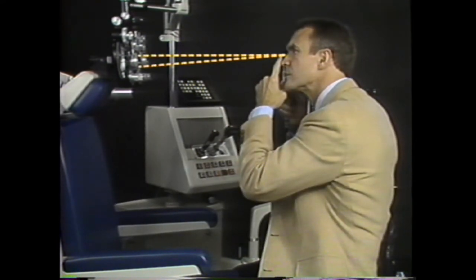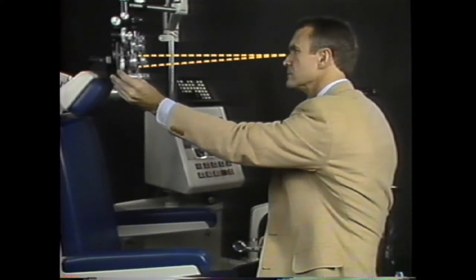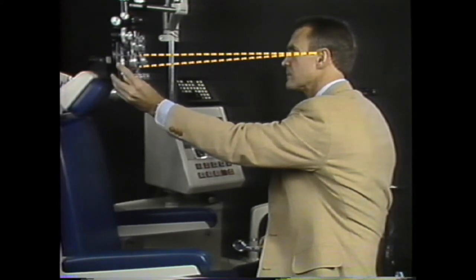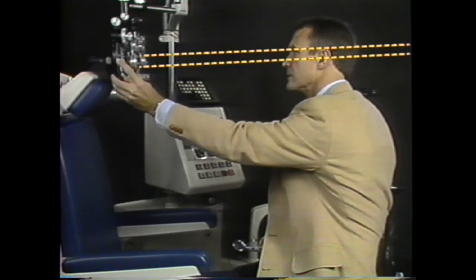That is, the eye is still focused at the position of the retinoscope. To move the far point to the far wall, or essentially to infinity, you must change the sphere one and a half diopters in the minus direction. There's no need to look at the numbers — simply dial six clicks up.